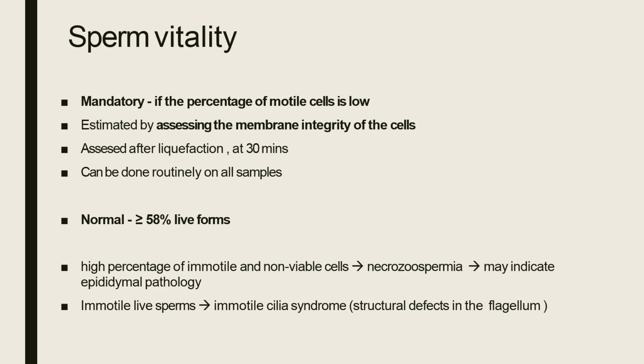Sperm vitality is measured after liquefaction at 30 minutes, and it is usually done on all samples. The normal values provided by WHO 2010 are greater than or equal to 58% of sperms alive, which means normal vitality.